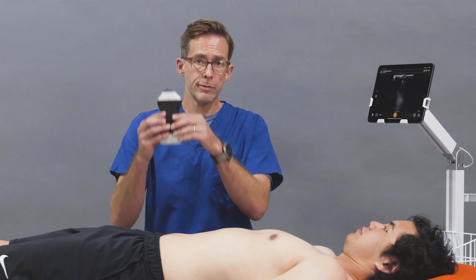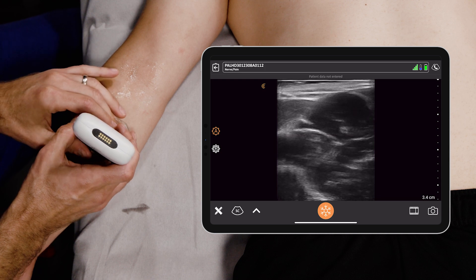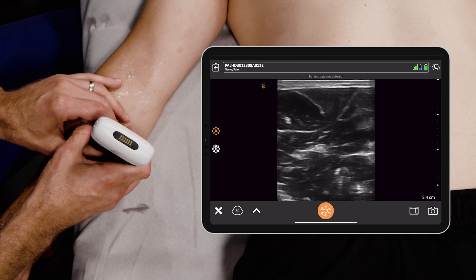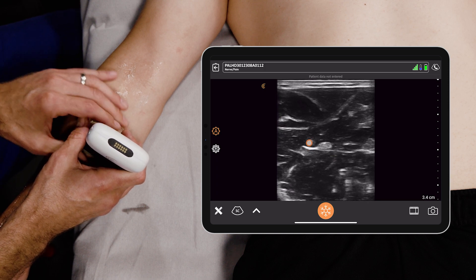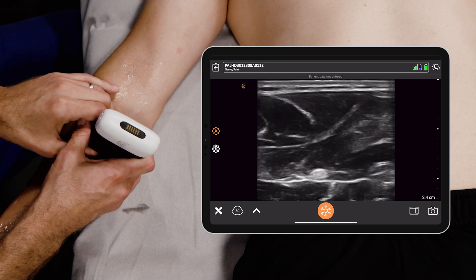You take the probe and you go basically to the mid forearm. The good thing about the median nerve is it doesn't run with any vasculature, typically, and it sits right in the middle of the forearm. What you're seeing right now is the median nerve sitting right in the middle of our screen. We can adjust the depth to really get that as big as we can.